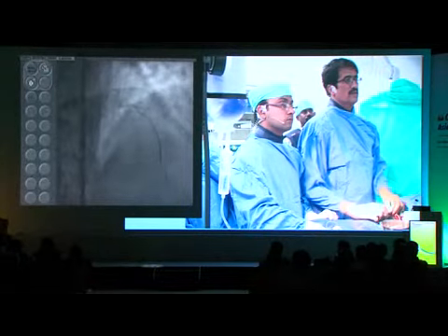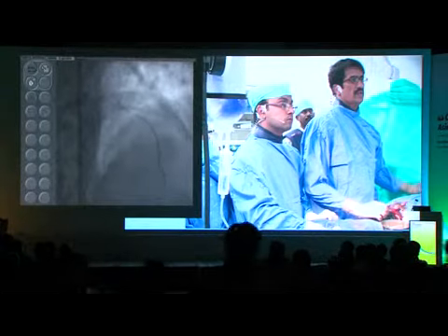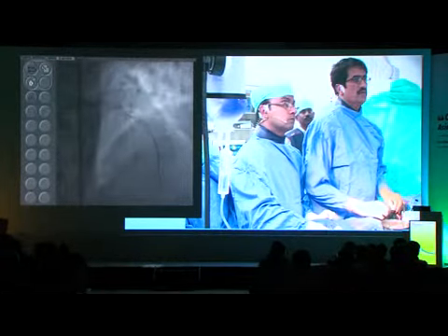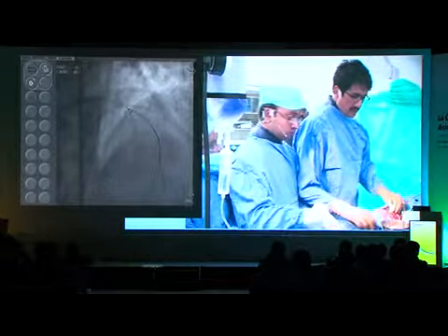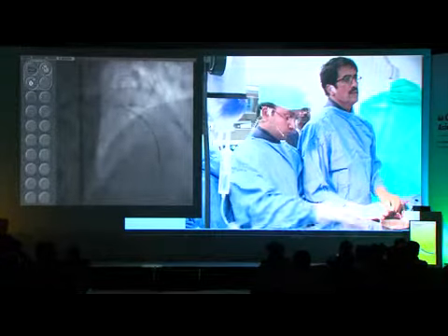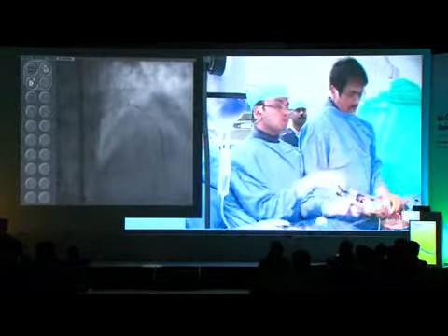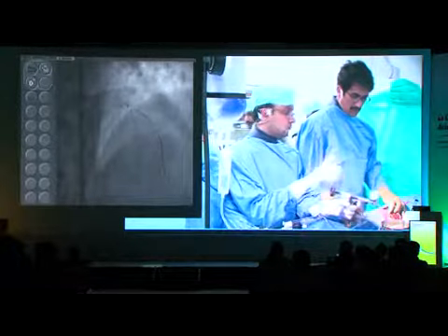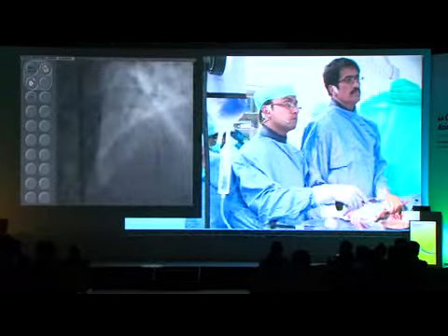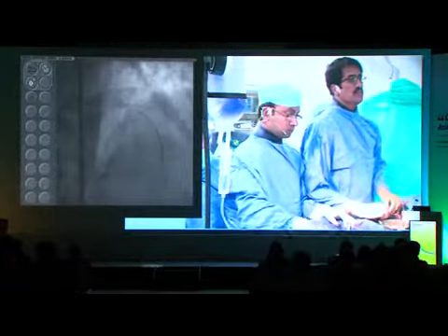No, actually I did that. I pushed the diagonal distally. But I think the two wires are getting very close to each other. There we are, okay. So we have two metals touching each other in the diagonal.